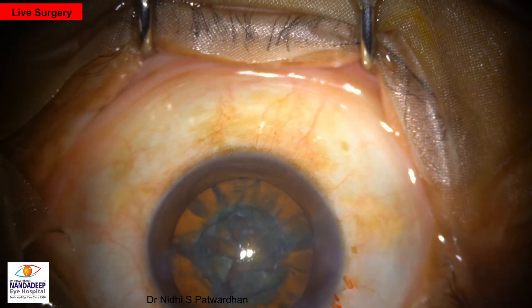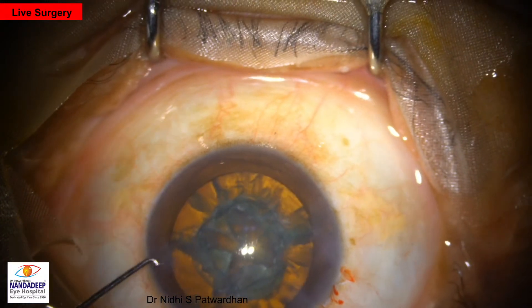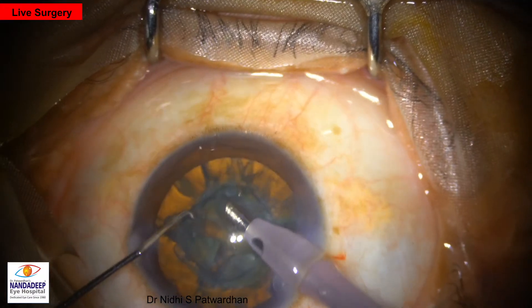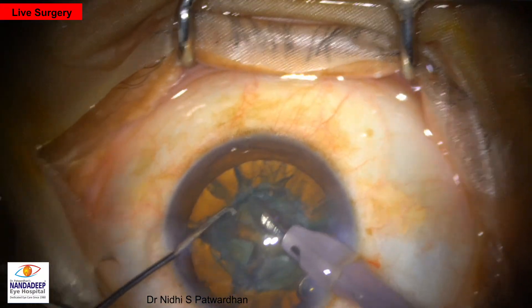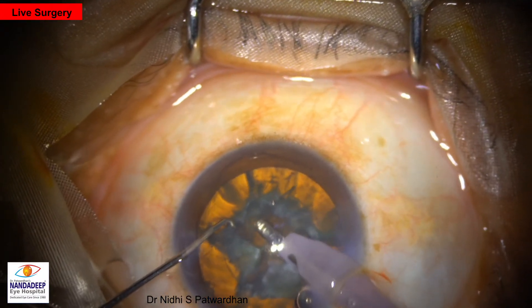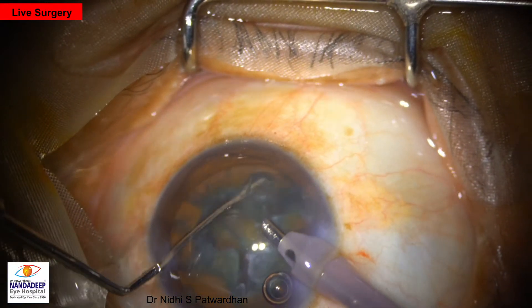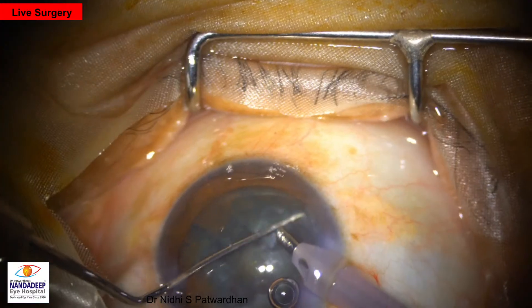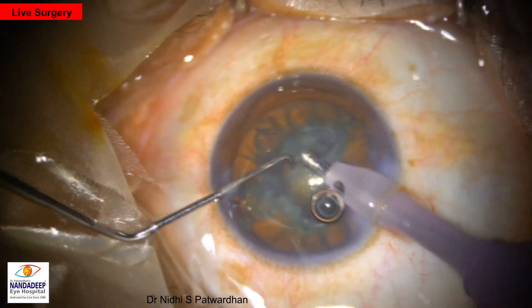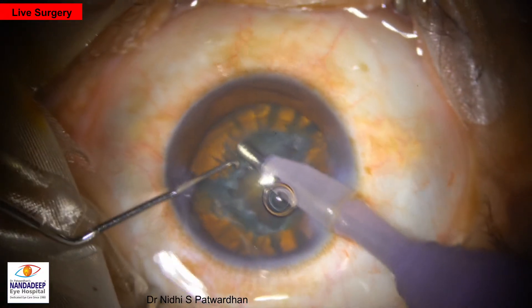It is important to keep the patient's eye in the center of the microscope, and many times some patients tend to move their chin during the surgery. Now the quadrant removal will be away from you. Now the first quadrant is being removed. The pieces have to be well separated before you remove the first piece.